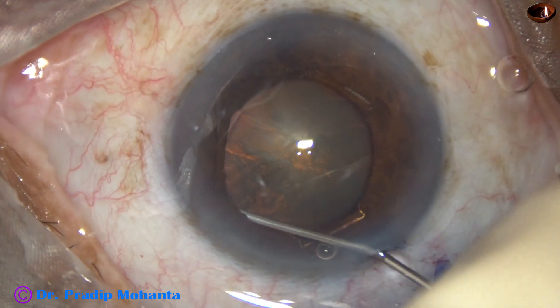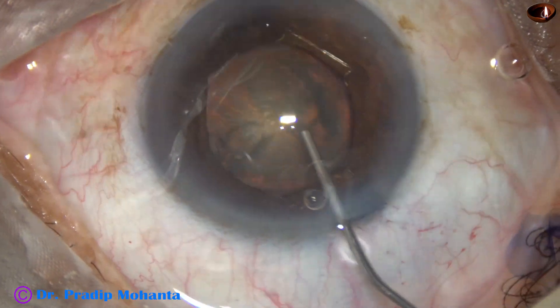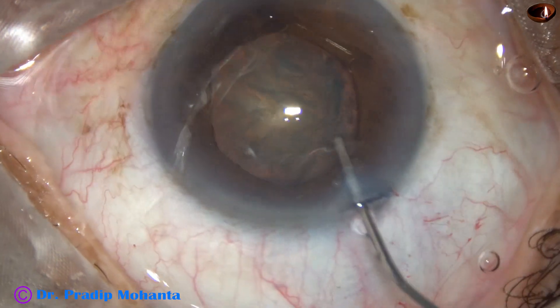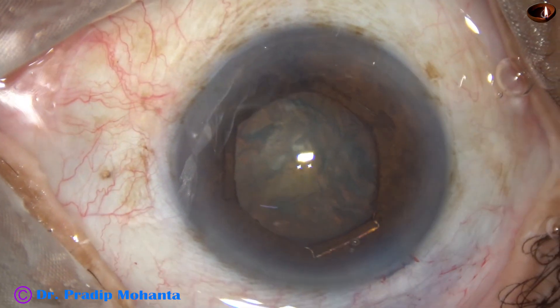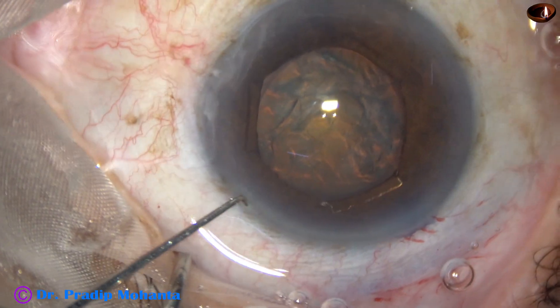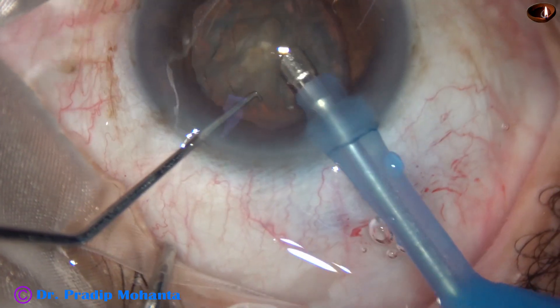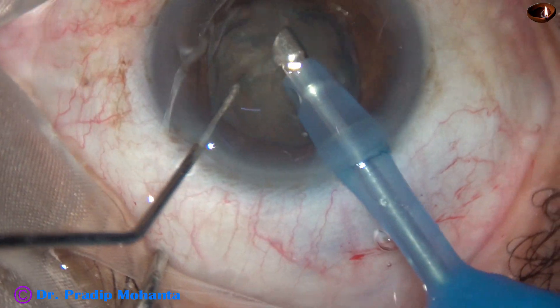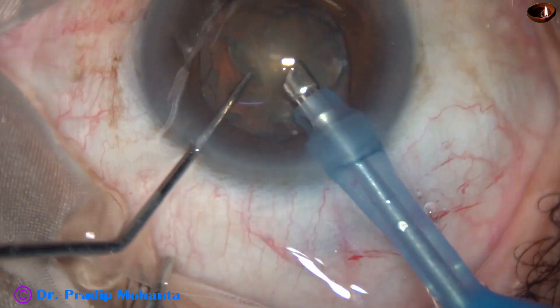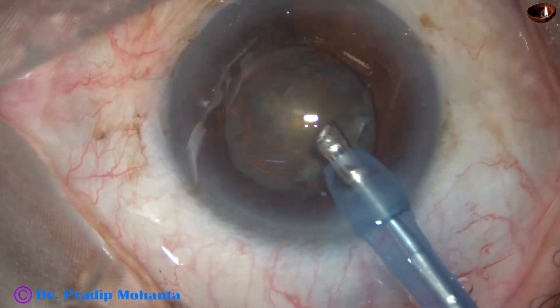And now this is hydrodissection. The fluid wave goes from one side to the other side. The nucleus is tapped. The lens mass is tapped from above, and the nucleus rotates nicely. Now the phaco needle goes with its bevel down and some superficial lens matter is removed. Then the handpiece is turned to make the bevel up.